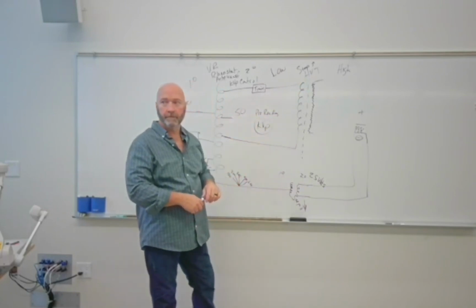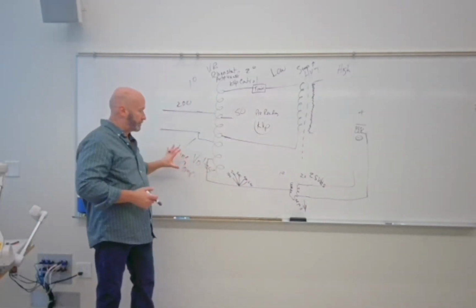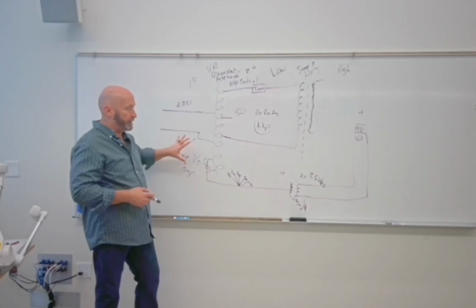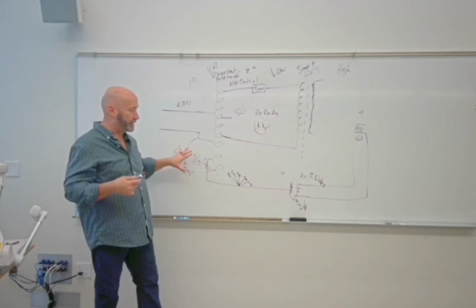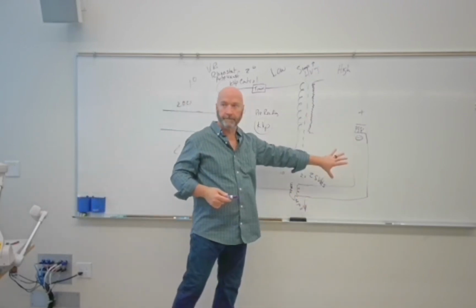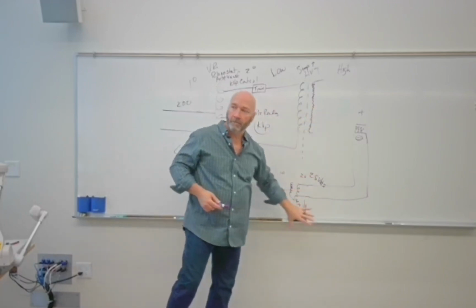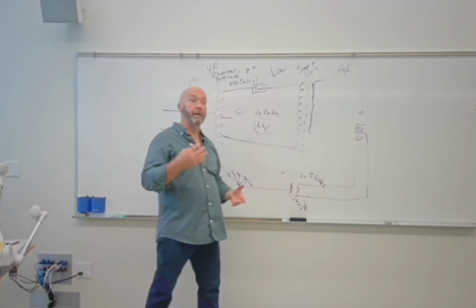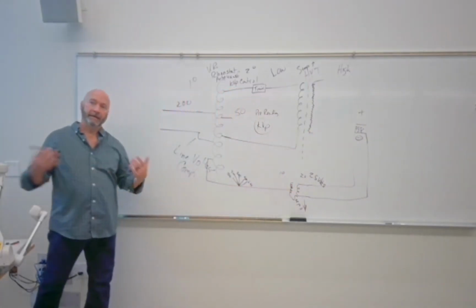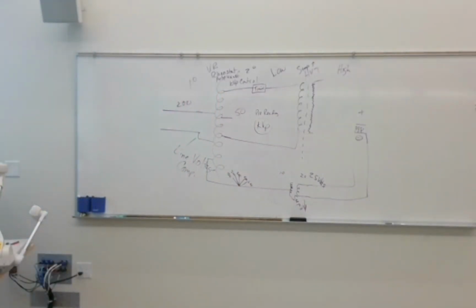All right, so when you press your prep button, you get the rotation of the anode. We've touched on it, but we'll get there. But we energize all this down here, right? We'll make our adjustments to our KVP. We don't have KVP yet. We're just energizing this to get us to the point of thermionic emission. We create a space charge in preparation of making x-rays. You're not making any x-rays yet. Everybody with me so far?